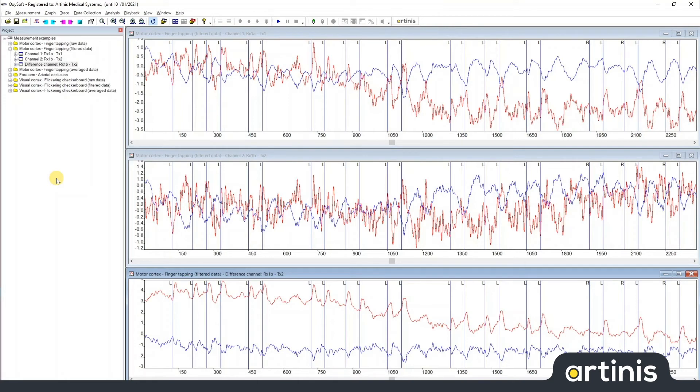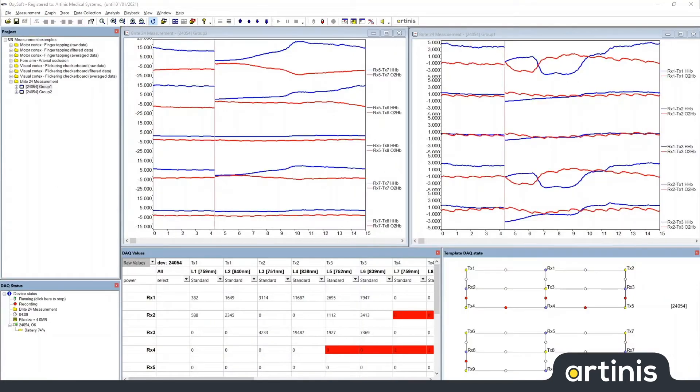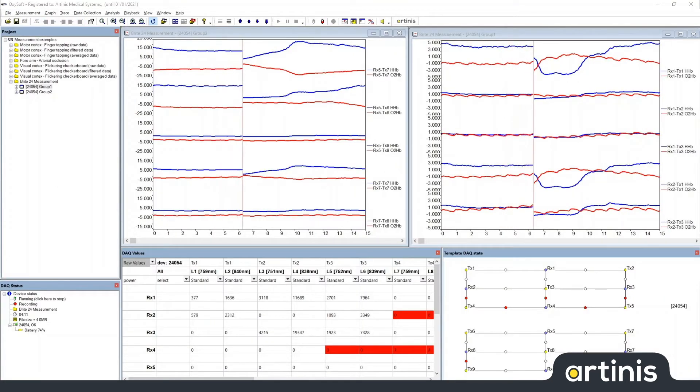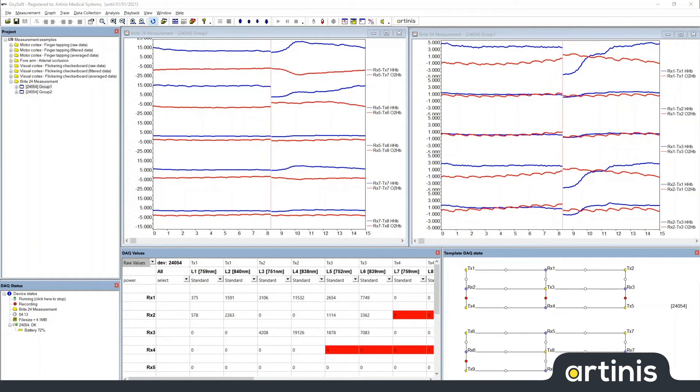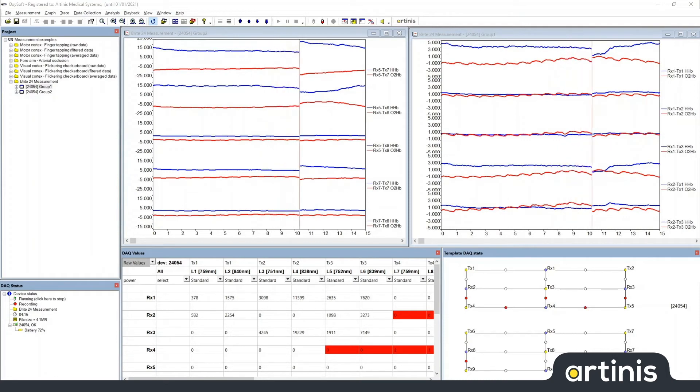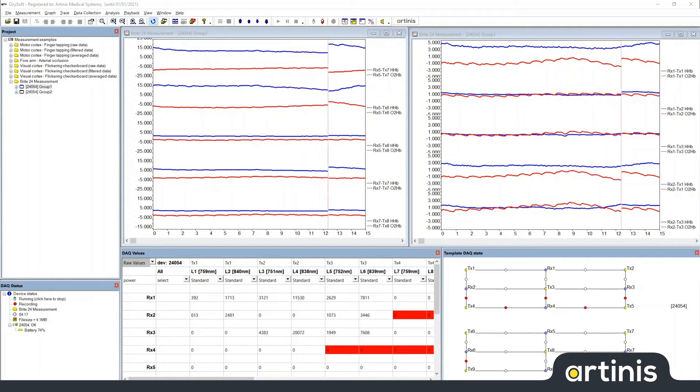When a measurement is running, there are additional interface elements that can be displayed in the workspace. Here I skipped straight to the measurement running. You can now see that there are three additional windows in the bottom of the screen.